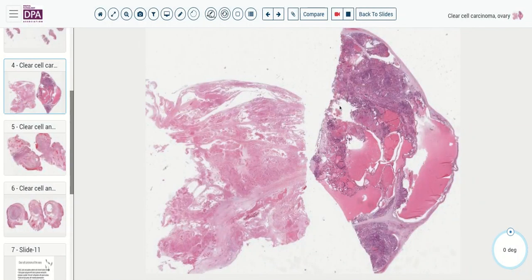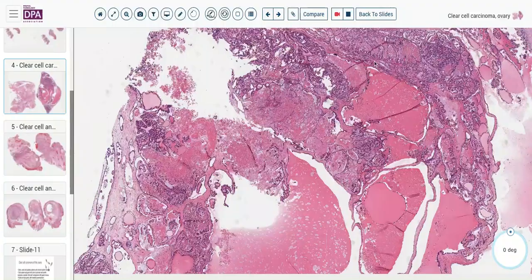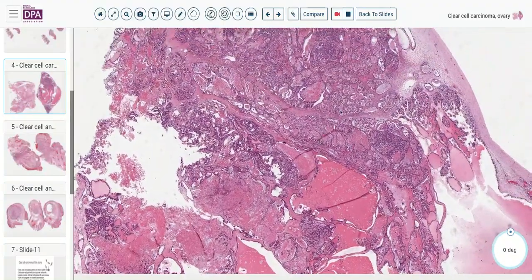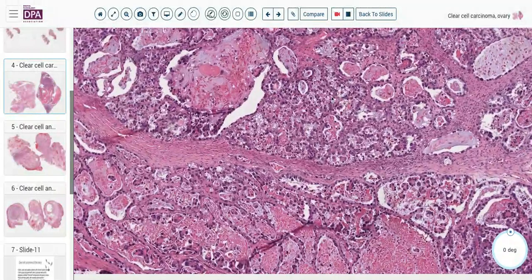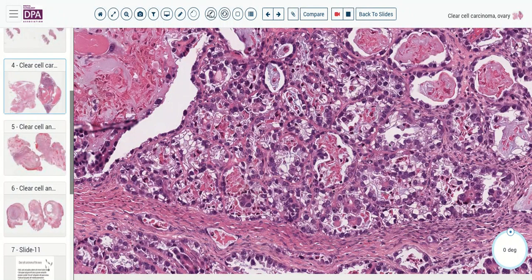Moving on to the ovary, here we have a section of ovarian tumor, and here another section that looks virtually entirely necrotic. Focusing on the well-preserved section, we see a mixed cystic pattern with some red-tinged fluid, some papillary structures, and some microcystic areas. Looking into this well-preserved area, we see cells with a small microglandular pattern and again the apical location of some of the nuclei.